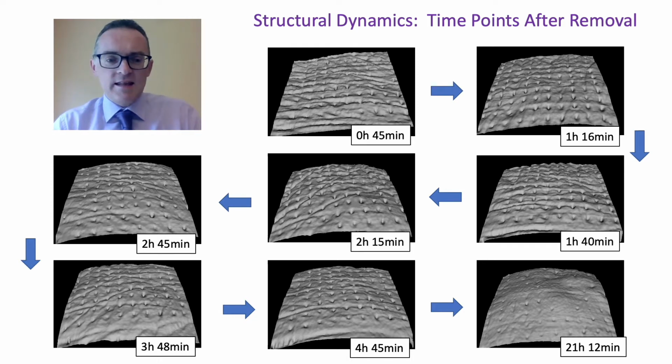What we see in this series of images is skin recovery after microneedles have been inserted in the skin. At 45 minutes, you can still see many of the skin pores using optical coherence tomography. They would not be visible to the naked eye, and we would probably have seen the transepidermal water loss, which is an important measure of skin barrier function, returning to normal much quicker even than 45 minutes.